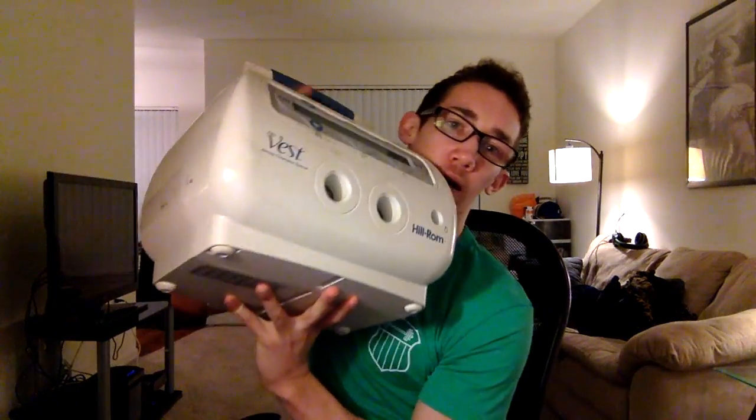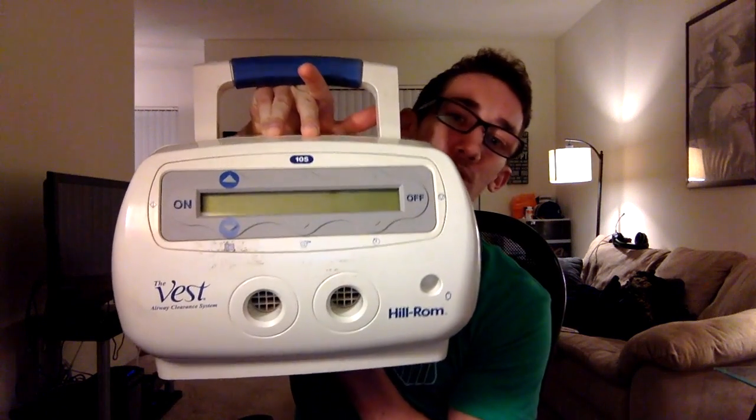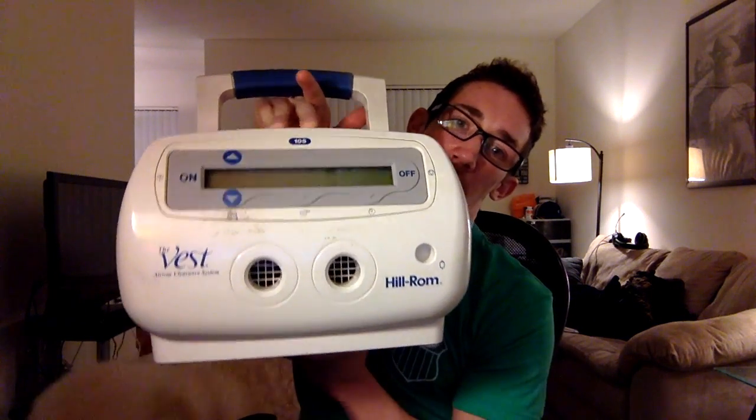The standard of course is the Vest, and I have one here. I've used it since I was probably eight or nine years old, maybe even before that. I used to have the big one — it's like 30 pounds, you lug that thing in the car. What I don't like about the Vest is it never really made me cough.